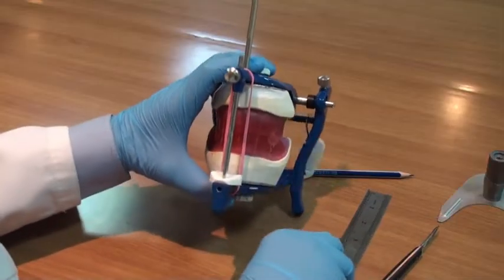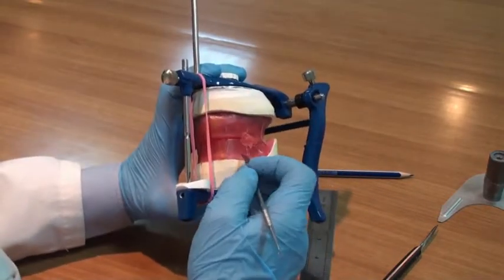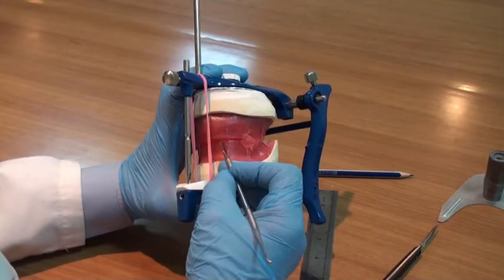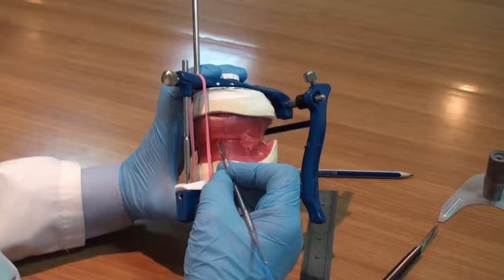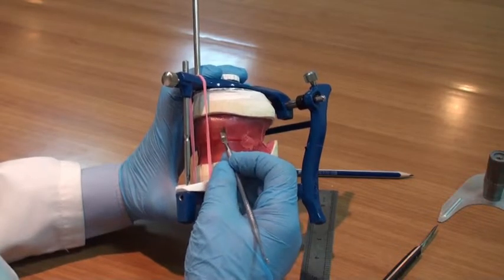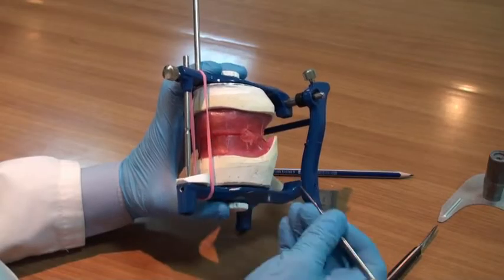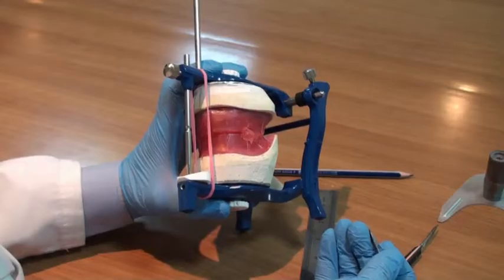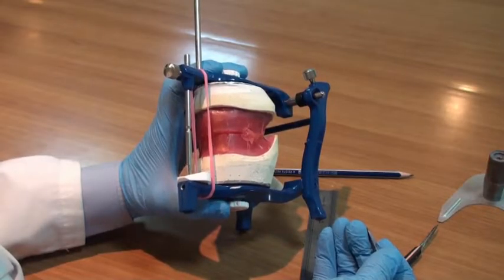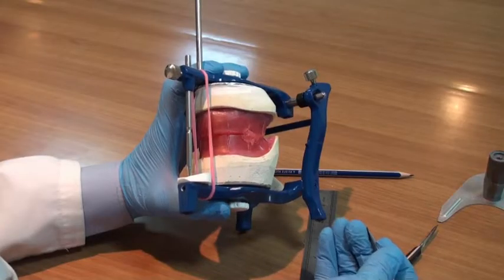Another important piece of information and a clue in the wax rim is the amount of horizontal distance or horizontal overlap between the maxillary and mandibular wax rims in the anterior region, commonly known as the overjet. This will determine the horizontal relation between the upper and lower anterior teeth.